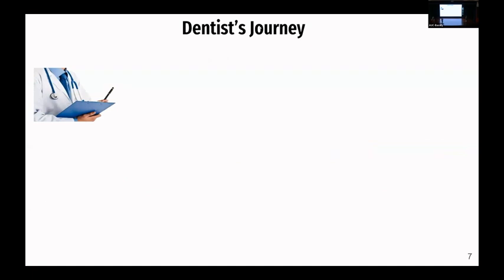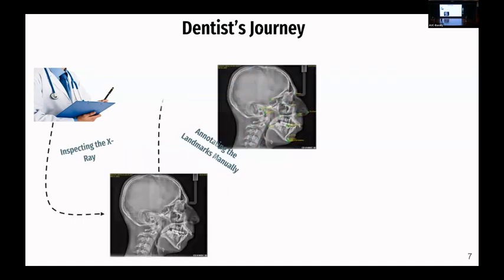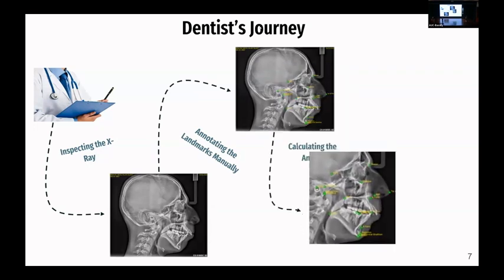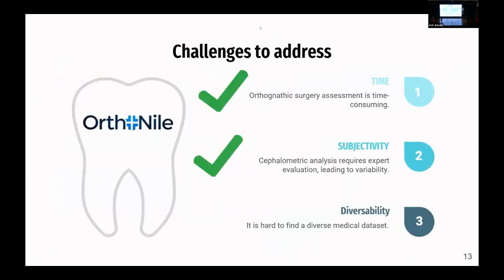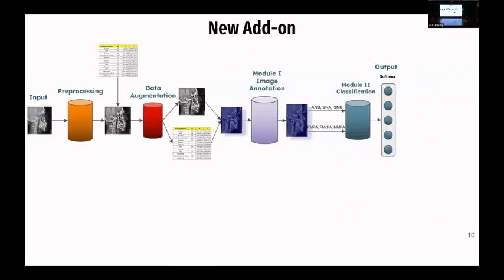But before introducing our solution, we need to understand the dentist's journey. The dentist starts by exploring and inspecting the X-ray. Then they start by annotating the landmarks on the skull. Then from the landmarks, they calculate some angles, and using those angles, they diagnose the case.